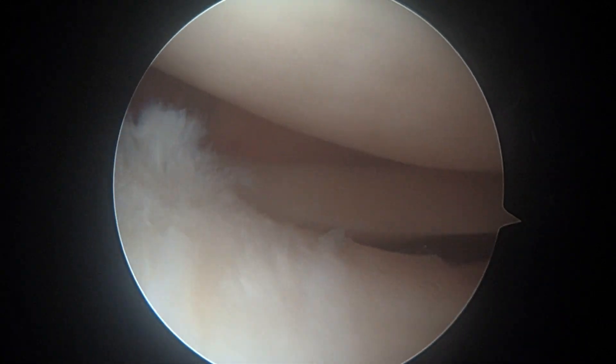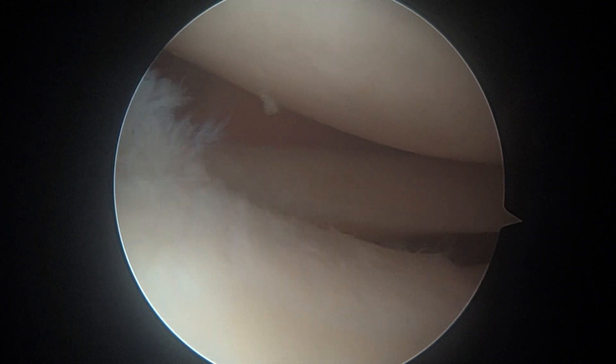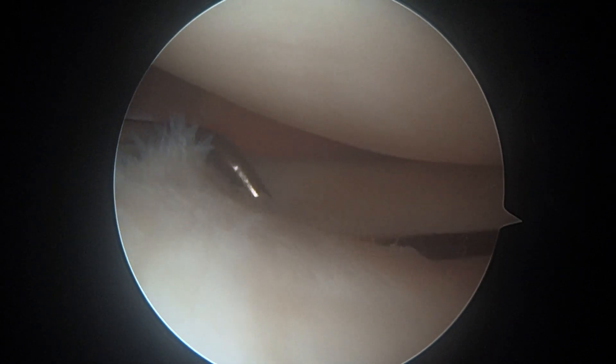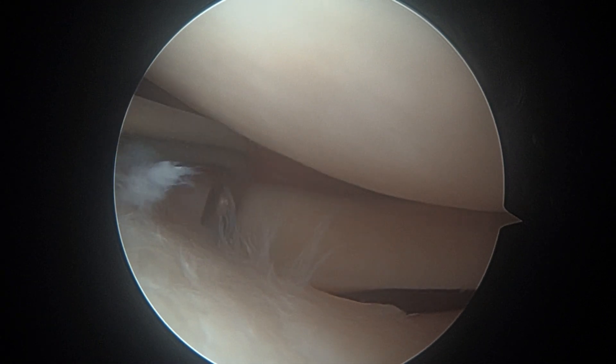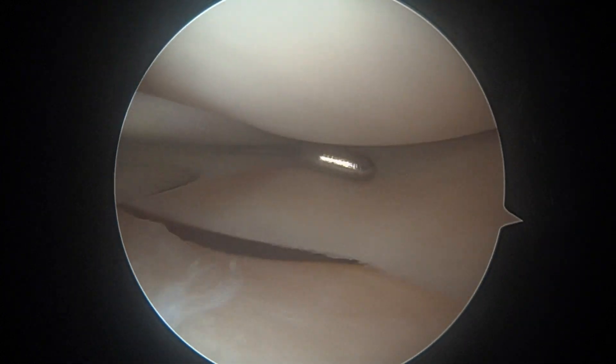Okay, so this is the lateral compartment — this is the lateral meniscus. It looks pretty good. I don't really see any significant tearing, so I'm encouraged by that. The less we have to fix, the better. Sometimes the meniscus will tear back here a little bit — there's maybe a little bit of fraying right there, but that's nothing to worry about.